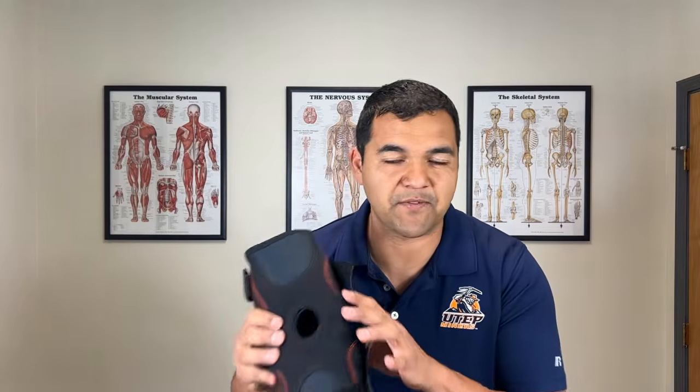Now, a common con with all knee braces, I've yet to meet a brace that doesn't have this problem, so this isn't just specific to the Shock Doctor knee brace, is they all slide down your leg. Once you have it on in place and you cinch it down and you start going on with your day, that brace tends to work its way down your leg and you find yourself constantly reaching down to pull it up because it just keeps sliding down.